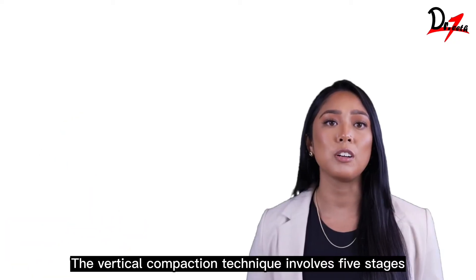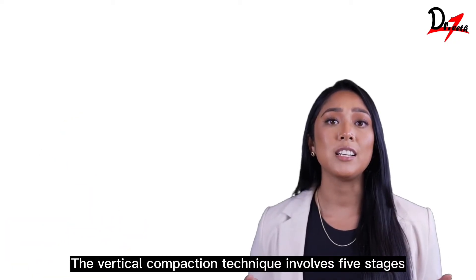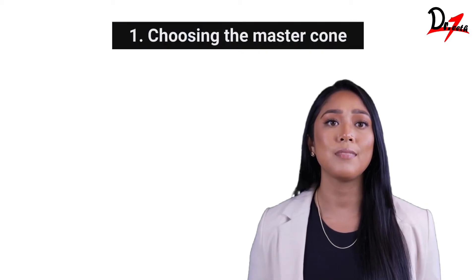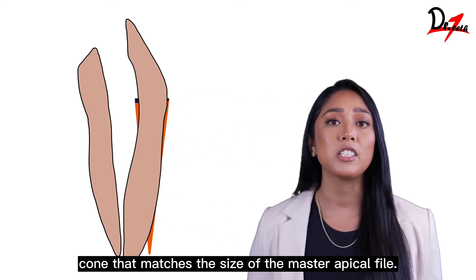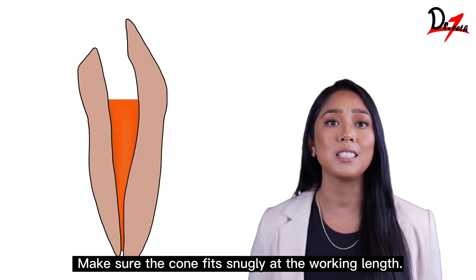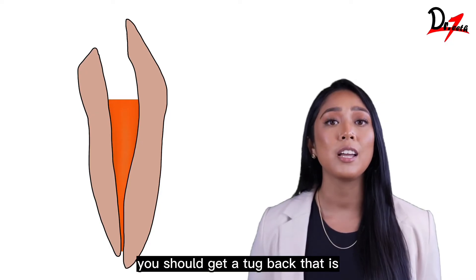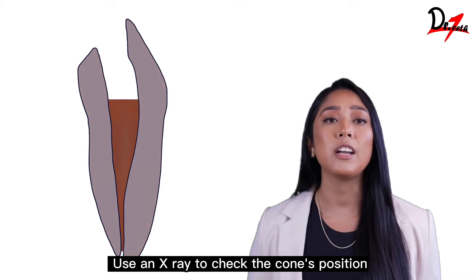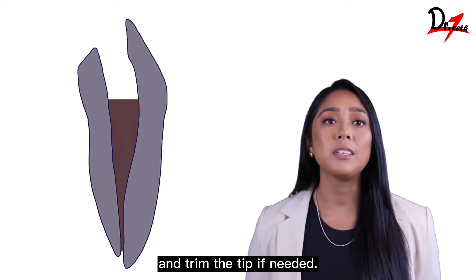The vertical compaction technique involves five stages. Stage 1: Choosing the master cone. Pick a gutta percha cone that matches the size of the master apical file. Make sure the cone fits snugly at the working length — you should get a tug back with slight resistance on removal. Use an x-ray to check the cone's position and trim the tip if needed.